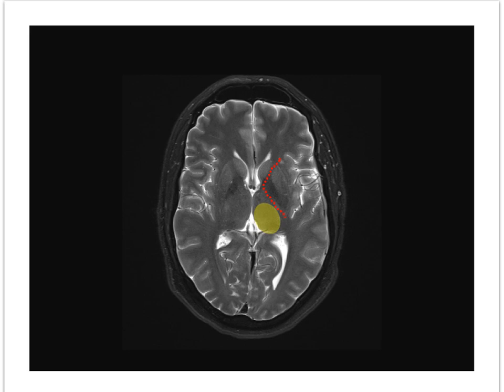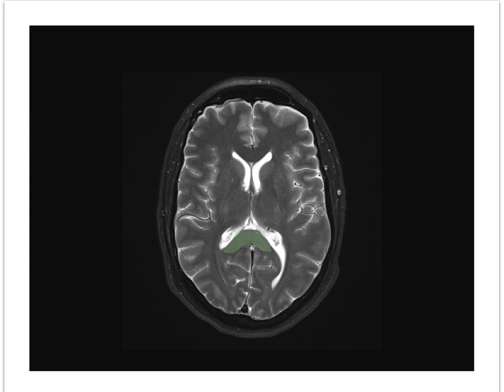The thalamus is roughly egg-shaped and presents a convex margin toward the third ventricle. This image shows the splenium of the corpus callosum, an important landmark also seen well on sagittal images. The occipital horn of the left lateral ventricle is seen here extending posteriorly from the atrium of the lateral ventricle. Contained within the lateral ventricle is choroid plexus that produces cerebrospinal fluid.